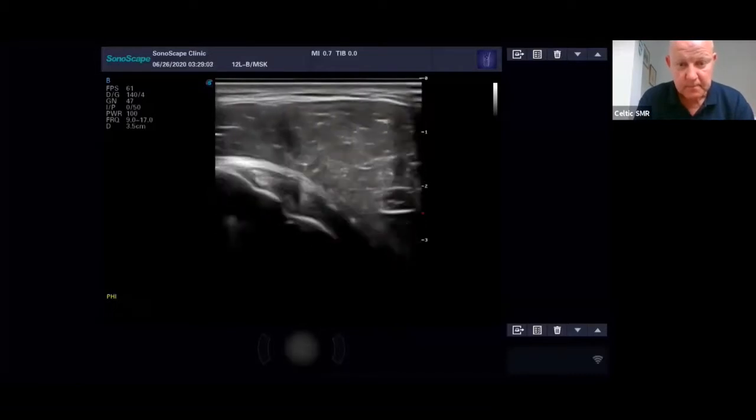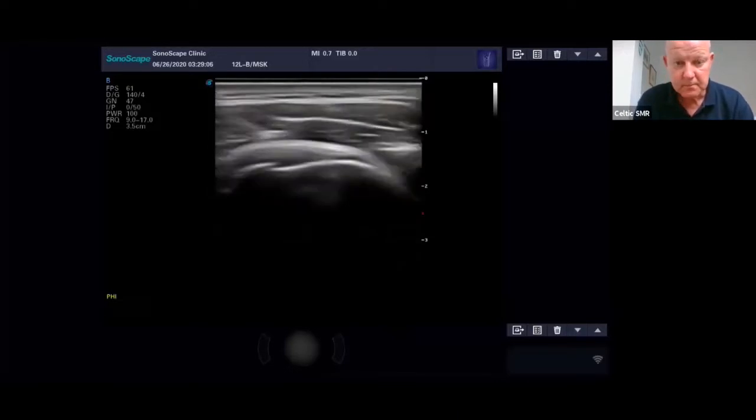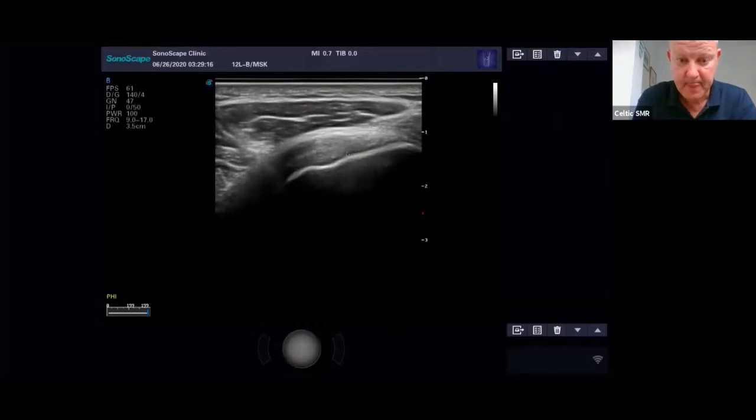Sorry, I was going to try and get a better image for the viewers there. Okay, so coming round, and I'm just angling in now. Let me freeze that. See how this now is all bright. So I'm pretty confident that Abid's infraspinatus is looking nice and healthy there.